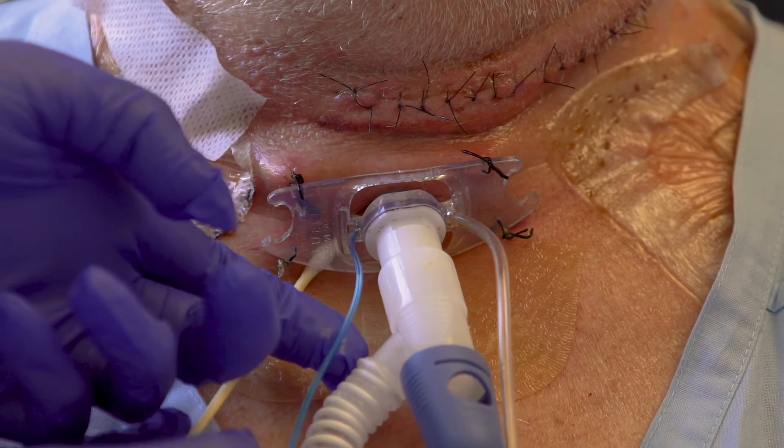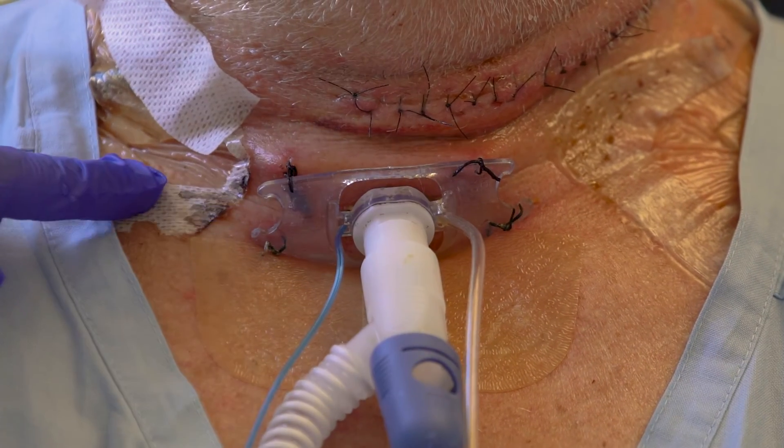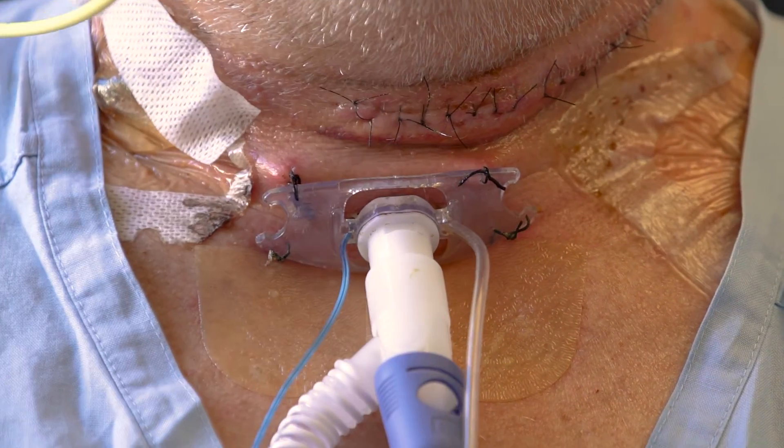Assess the stoma for pressure areas, infection, inflammation, or pulsation. Notify the treating team if there are any concerns.